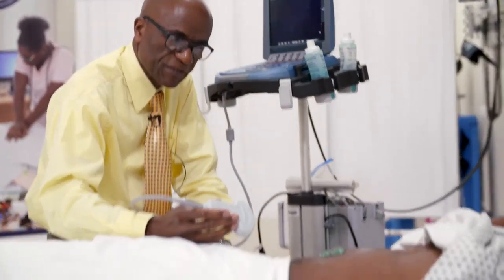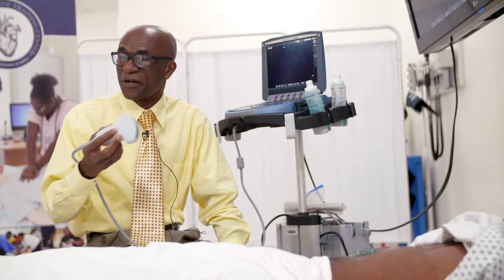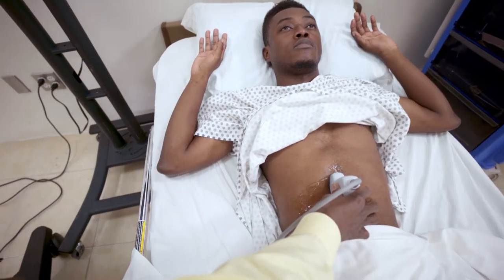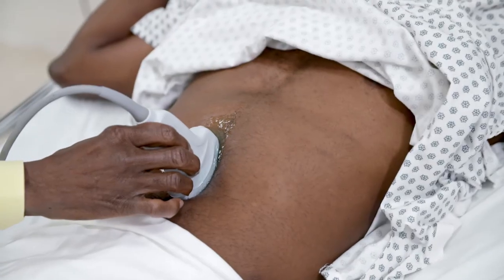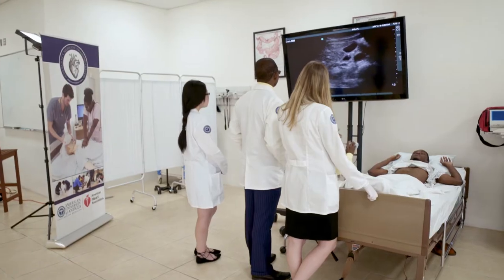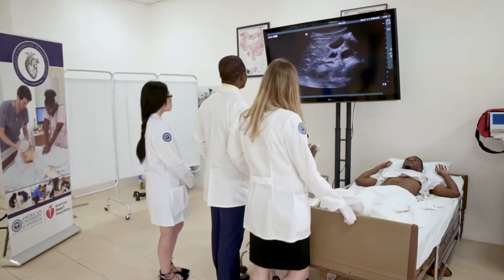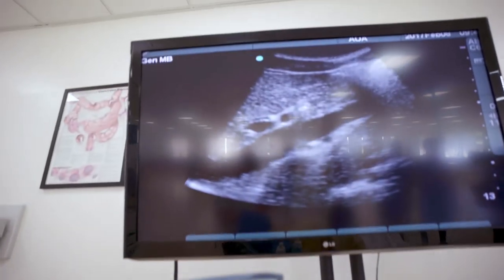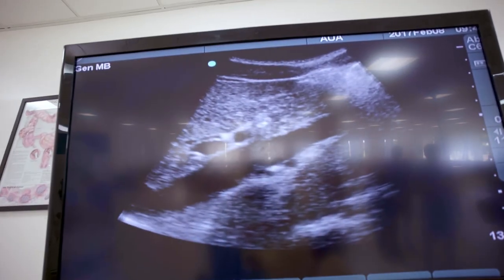An ultrasound image is obtained using sounds. We allow students to use the ultrasound to enhance their knowledge of anatomy. So take a deep breath and hold it. The top of the image is consistent with the abdominal wall, and we have an echoic image there.